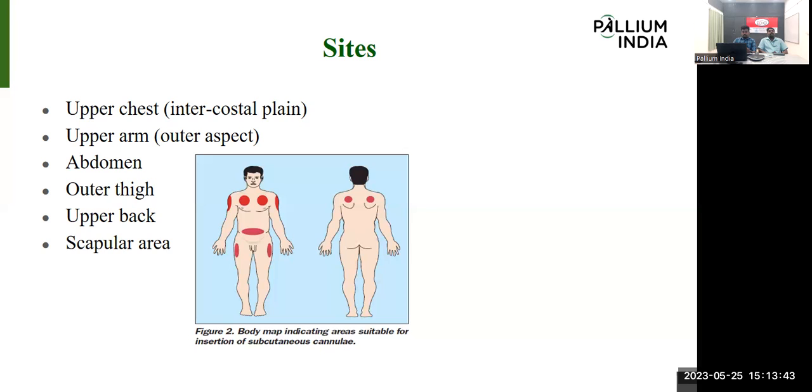Then the last one is the scapular region. On both sides of the back, the scapular region, we can give the subcutaneous injection. These are all the common sites where we can give the subcutaneous injection.